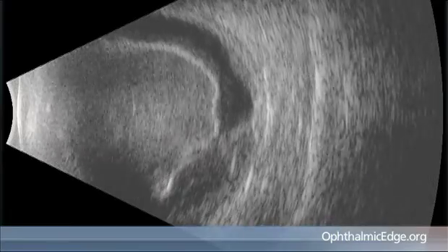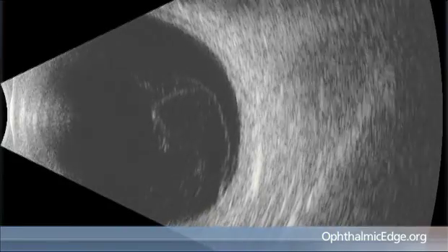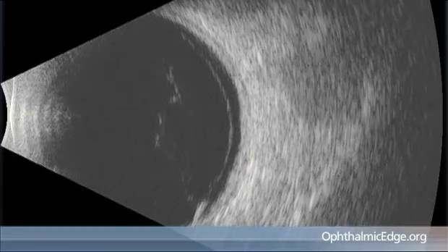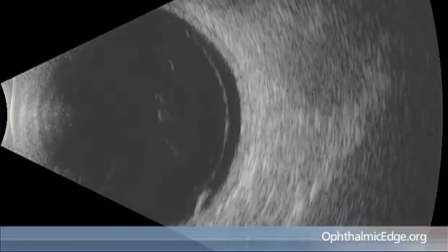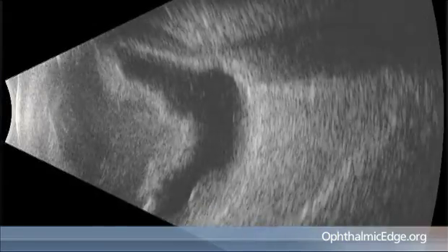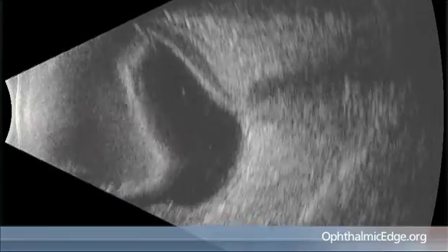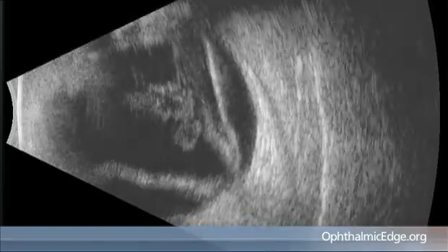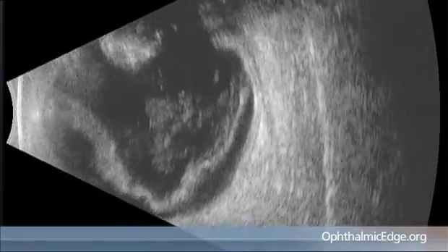So how do you make the eye move? With the probe held against the globe in any of the positions we've previously described, you have the patient voluntarily move the eye, and that will begin to shake the material inside. You'll see what's moving and what's not. It's very revealing, because you will rapidly realize that the retina undulates and the vitreous dances more quickly.